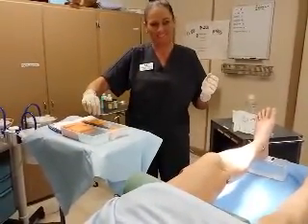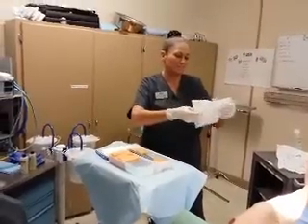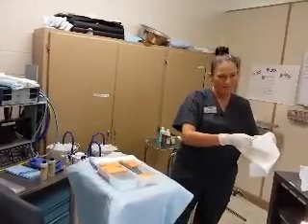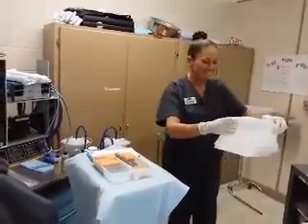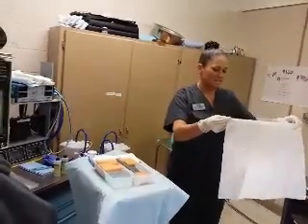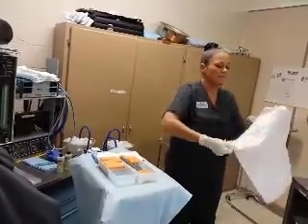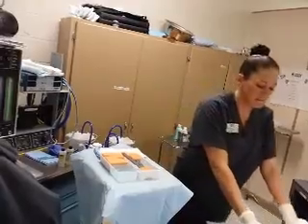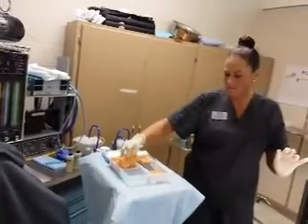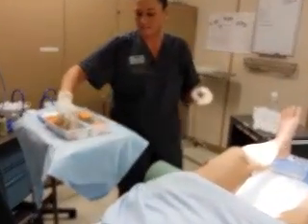Am I going to prep yet? No. It's kind of tricky because there's a drape down there, right? I just did that so you don't get solution everywhere. If I feel like I'm going to contaminate, remember I've got feet. There's a way to fix things. I can do it this way, but if I want a longer way, I can turn it. But anytime we drape something, we cuff our hands, correct? So I'm going to cuff. I'm going to come in, I'm going to let it drop just like that. That's all I need to do. So I only use one of yours. I'm just prepping from here to here. If I want to bring this back in a little bit, I can, because we have feet.